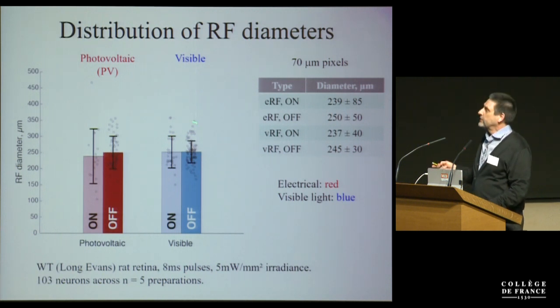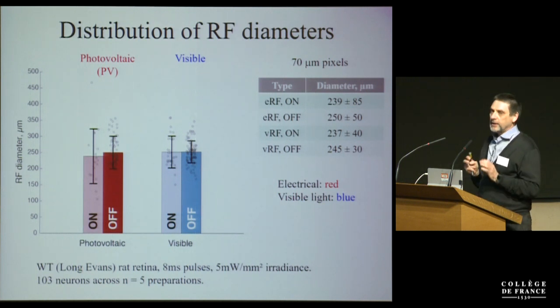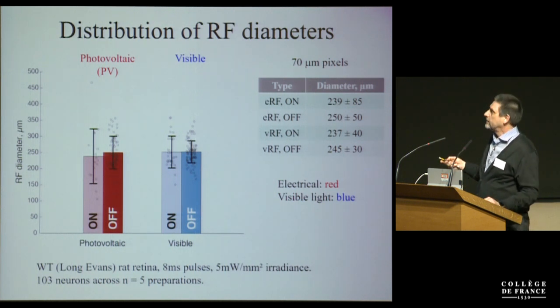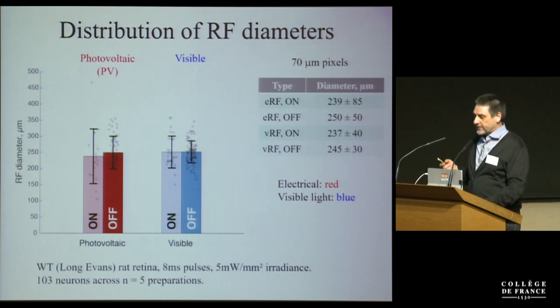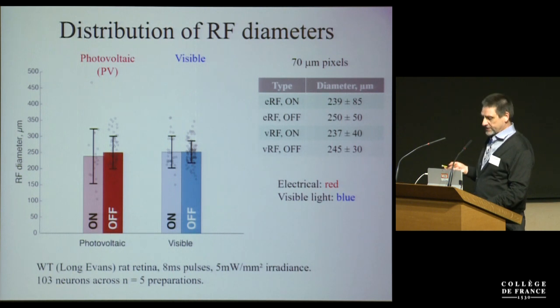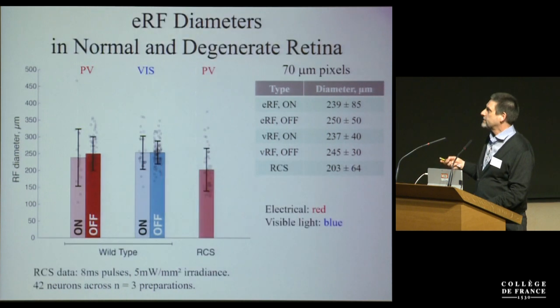And that means that the dominant factor now is the spread in the retinal network. The electrical pixels that we use in light stimulation are smaller than the spread of the signal in the retina, which is on average about 240 micrometer receptive field, and our pixels are only 70. So the dominant factor here is actually retinal spreading, therefore they are the same. But vision is defined not by the average size of the receptive field, but by sub-units of the receptive field, which go through different bipolar cells to the ganglion cell.